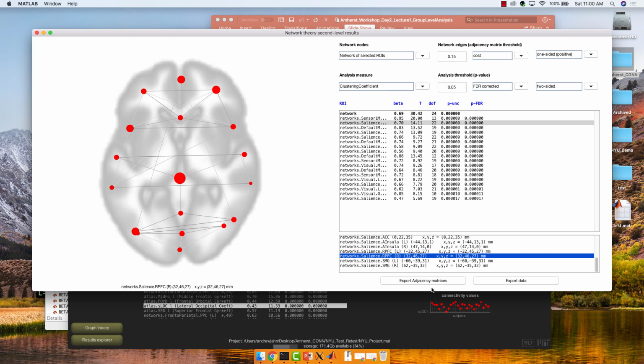Does that ring any bells? So if you're trying to condense your connectome into just a few modules, right? This isn't exactly the same thing, but it's a similar concept where you're only focusing on a few networks, and so your adjacency matrix is going to be reflecting like a more compressed connectome. Right?